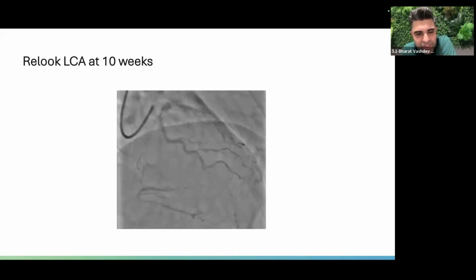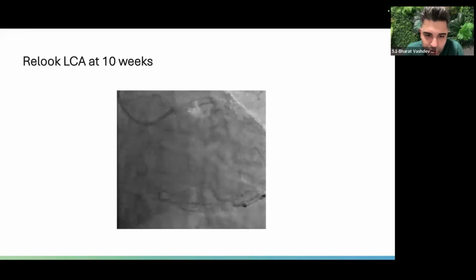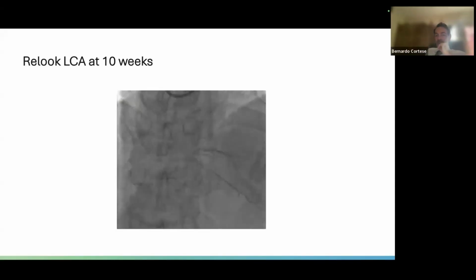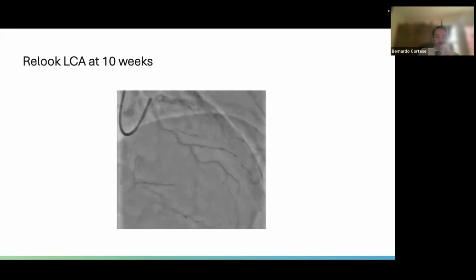And then the good thing about just stenting to the very proximal LAD is that the septal is still available should you fail an antegrade approach. Yeah. Now, this is an excellent result. Second question. Have you ever jailed a DCB?